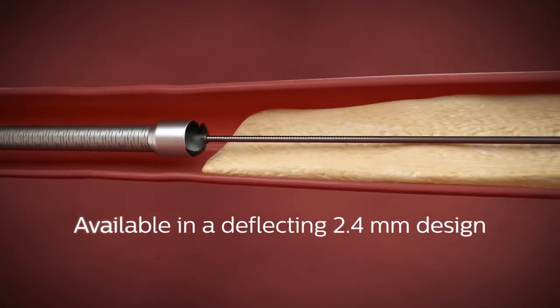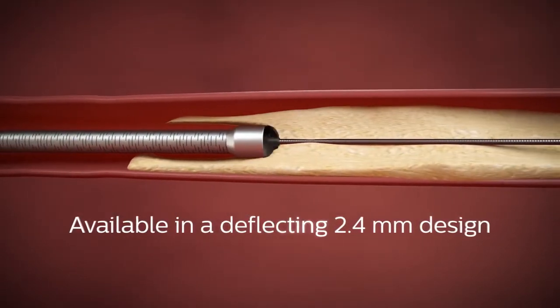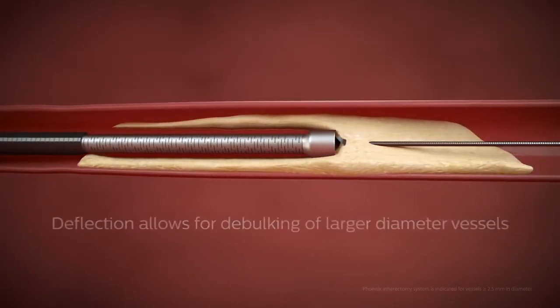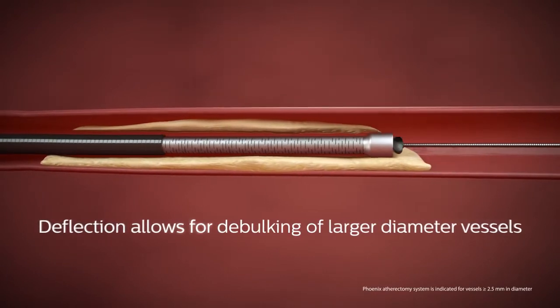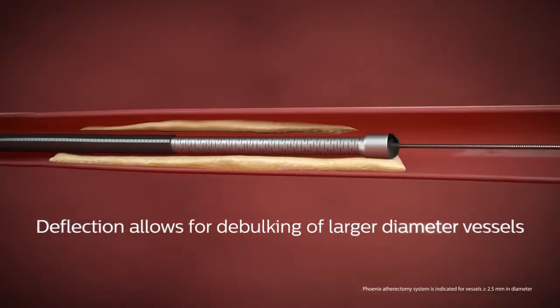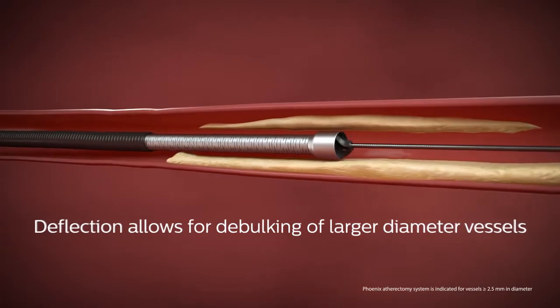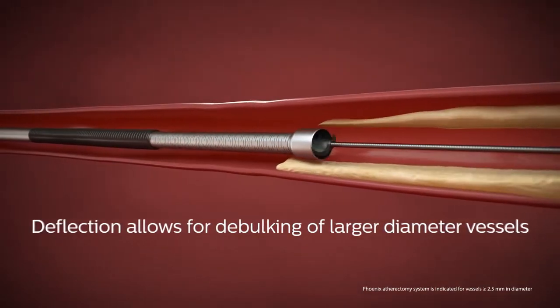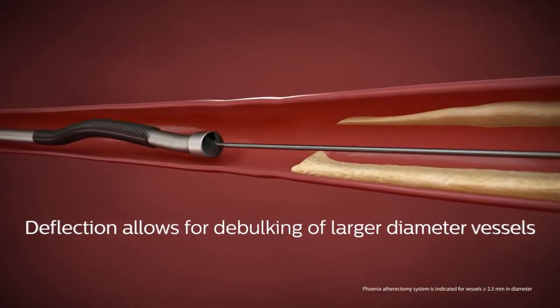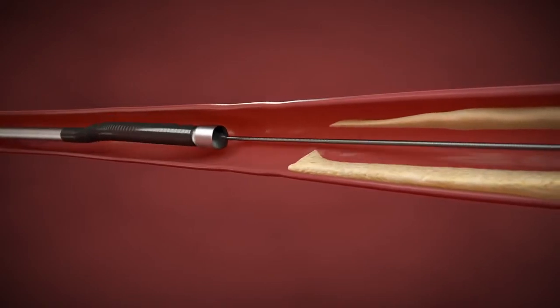Phoenix is also available in a deflecting 2.4 mm design to enable debulking of larger diameter vessels above the knee. After creating an initial channel by debulking in a straight fashion, the catheter tip can be deflected and rotated as needed to achieve the desired result.